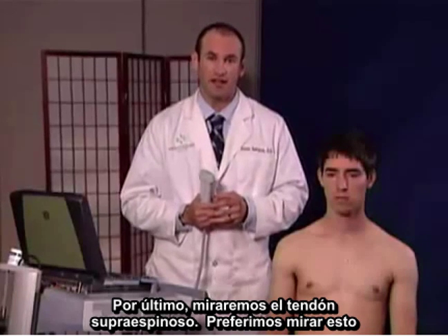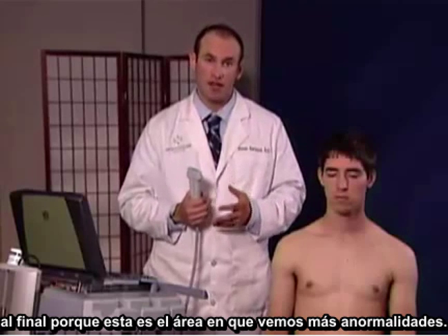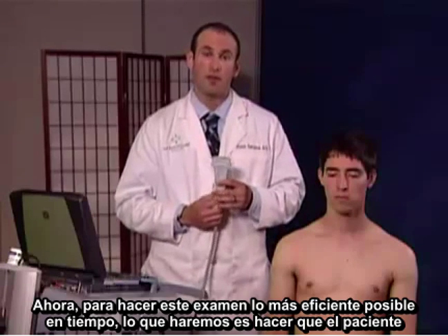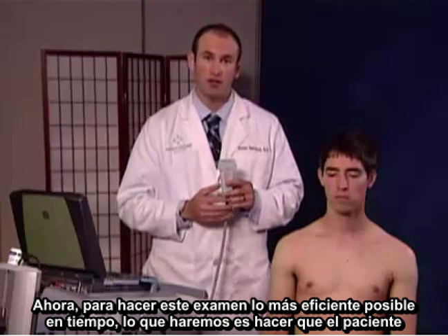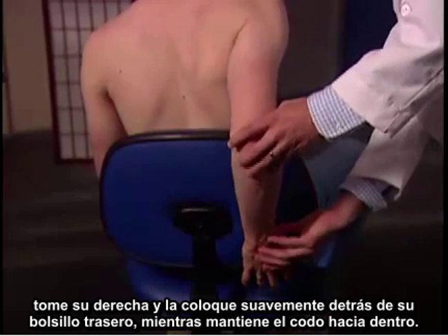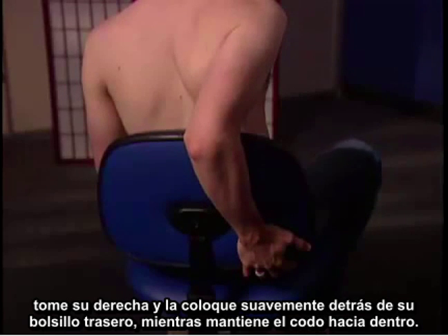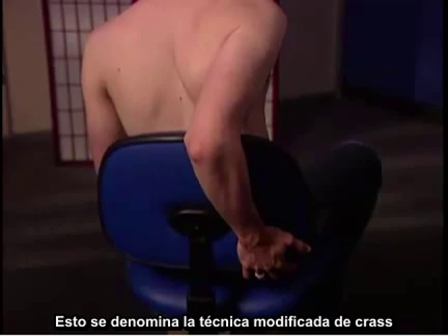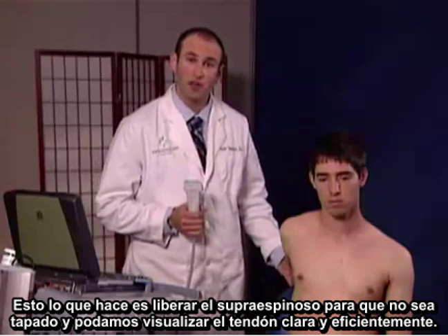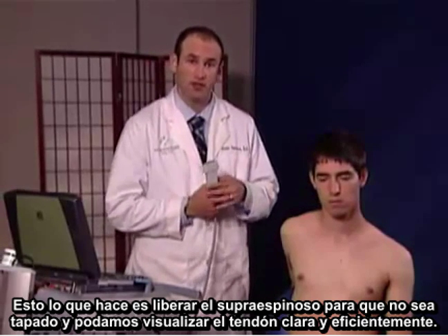Lastly, we're going to look at the supraspinatus tendon. I prefer to look at this last because this is the area where we see most abnormalities. To make this examination as time efficient as possible, I will have the patient take their right arm and slowly put it back behind their back pocket while keeping their elbow inward. This is termed the modified CRAS technique, which frees up the supraspinatus so it's not obscured and I can clearly visualize the tendon efficiently.